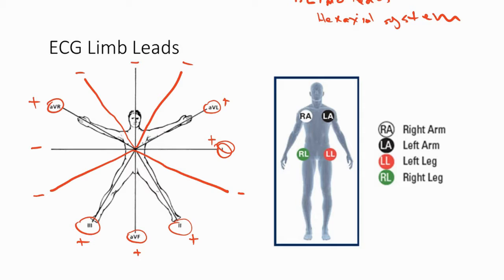And the only thing that you mentioned is that placing the leads maybe more proximal or centrally toward the body will help to eliminate a little bit of artifact. Correct. Which would especially be important in a young baby that's kicking legs and stuff like that. Correct. But if they're squirming around, you may even get some artifact with the leads placed this way. But yes, it does help to some extent.